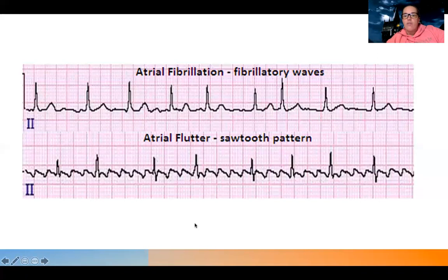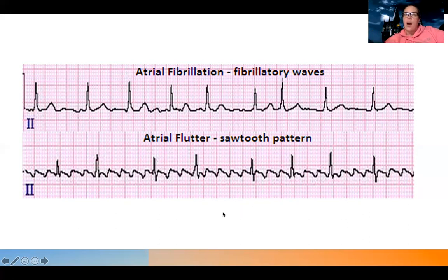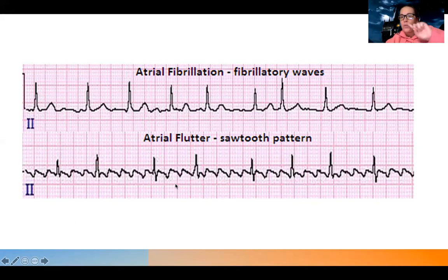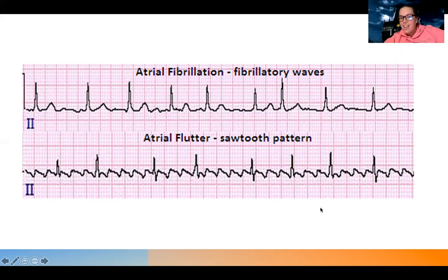Atrial flutter has the exact same problems as A-fib - everything I just mentioned applies. The only thing that's different is the look of the wave. Atrial flutter has what are called sawtooth waves - it looks more uniform and prettier. Some people might think those are P waves, but look how many there are. There's only supposed to be one P wave before the QRS. It's literally like sawtooth or shark's teeth - that's the sawtooth pattern of atrial flutter. It's a little more regular and predictable, but the same problems apply: blood pressure can be low, trouble oxygenating, poor cardiac output.